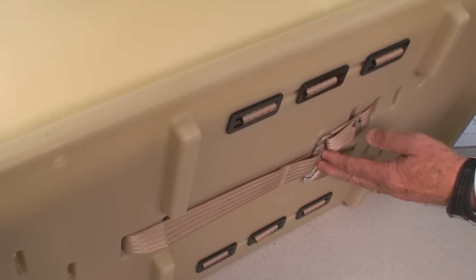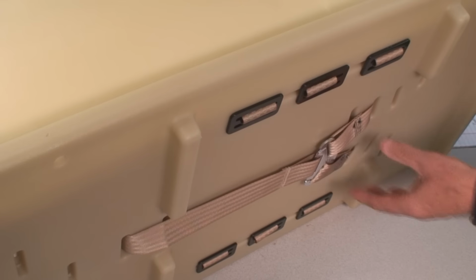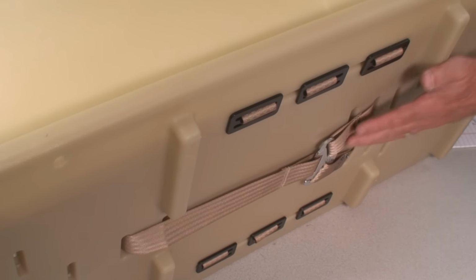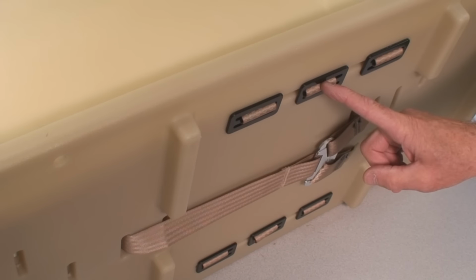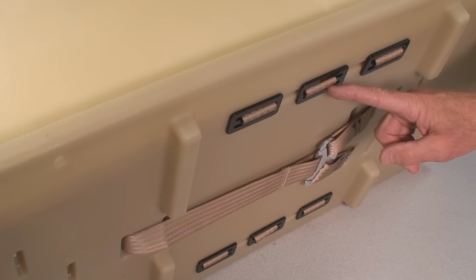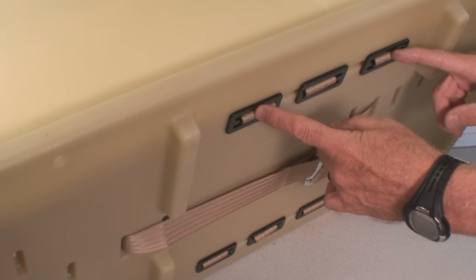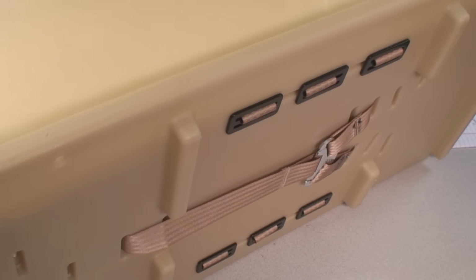We now have the metal splitter plate connected to the harness straps, and we pulled the A-lock strap tight, and this is how the bottom should now look. The two metal anchors are for the cummerbund, and the two metal anchors on the outside are for the restraint bag.